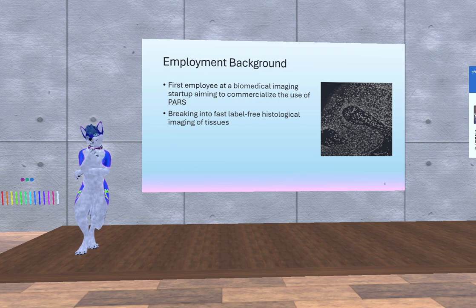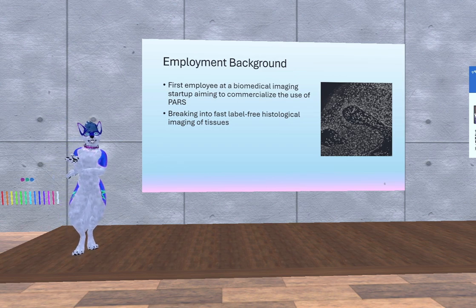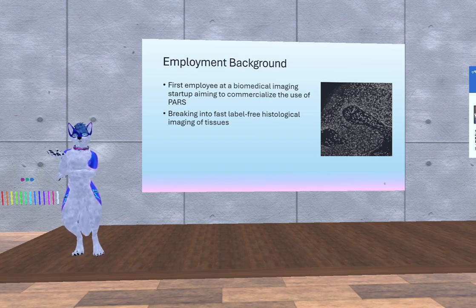So for example, similar situations that OCT is applied in, so ophthalmic imaging, you're looking at the anterior, posterior of the eye, or looking at diseases. Also in endoscopy, the other main use for OCT right now. You can make really, really small imaging probes where usually the whole actual system is external, but you just have essentially a little fiber going down. And this is used for looking at plaque buildup in arteries and so on. It's also used by dermatologists, and there's lots of pioneering work on being able to diagnose skin cancers just by looking at them with OCT. So I think these kinds of applications would be pretty far up there.